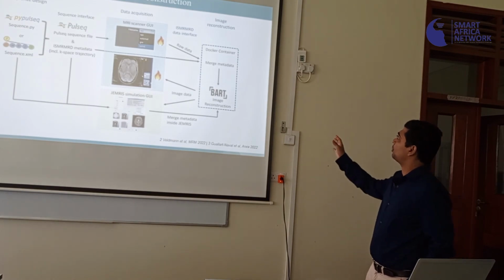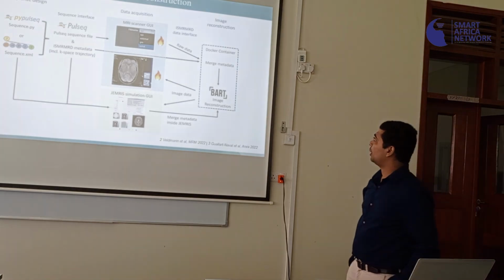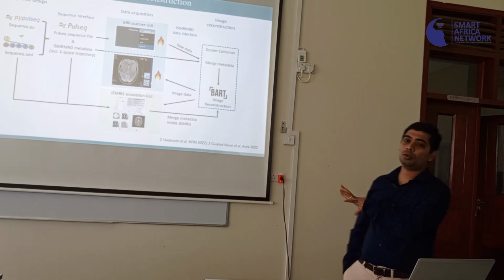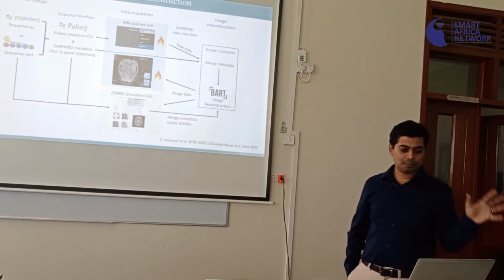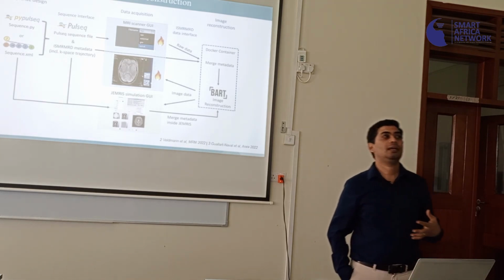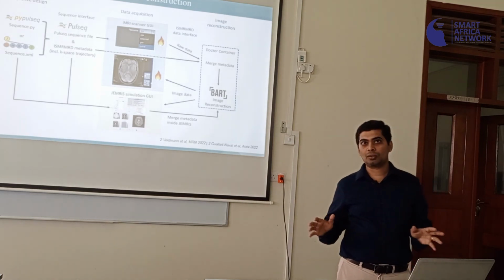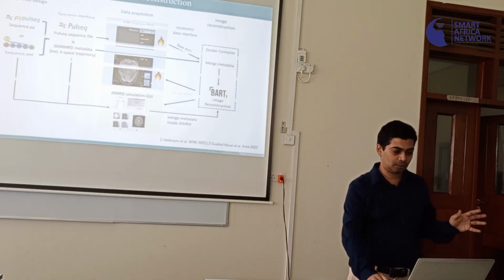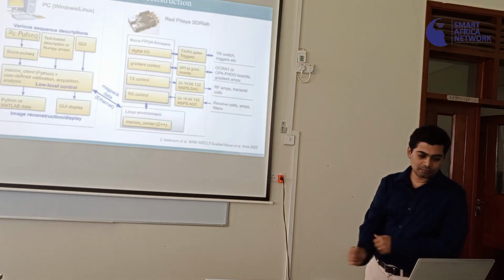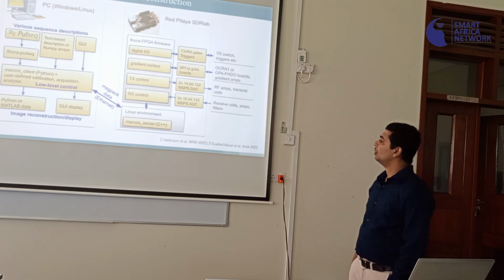And then you have something called the ISMRM, International Society for Magnetic Resonance in Medicine. They have their own data format, and then you have a reconstruction tool. So all of this is open source. This is one example. You can put a bunch of these pipelines together. But the focus of my talk today is, if your hardware is ready and you feel like programming it on your own, what are the options you have to do that? So the next level dive on that is to look at the architecture.